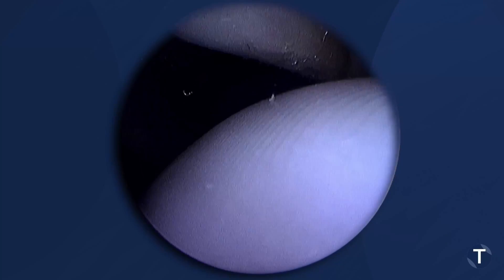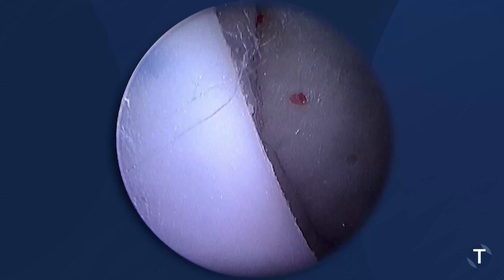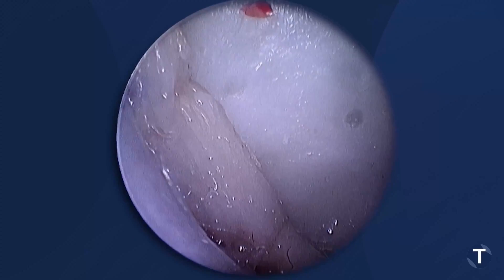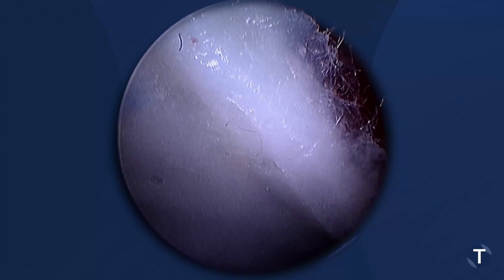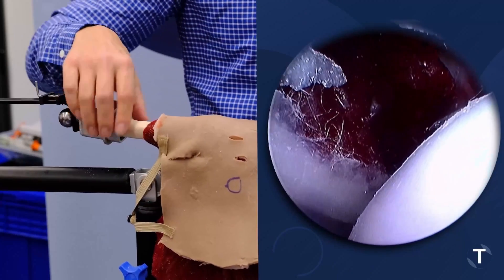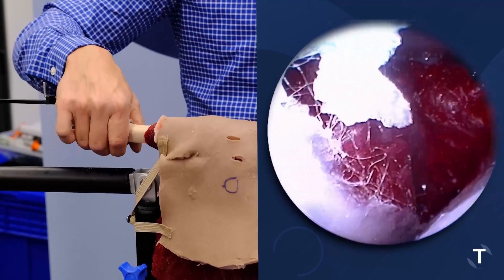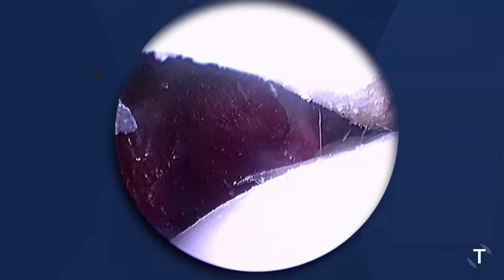You can see the dome of the humerus up to our biceps tendon. In the front here, you can see our labrum is actually absent — it's been displaced, torn off, and is now displaced medially. There's our middle glenohumeral ligament and the subscapularis muscle belly. You can see as we rotate, you can see the rotation of the subscapularis and your biceps tendon.